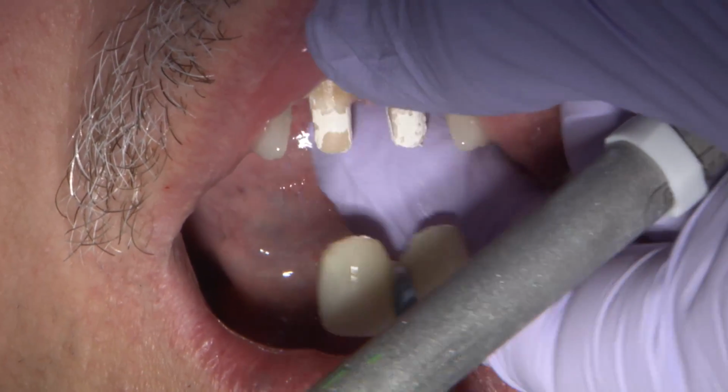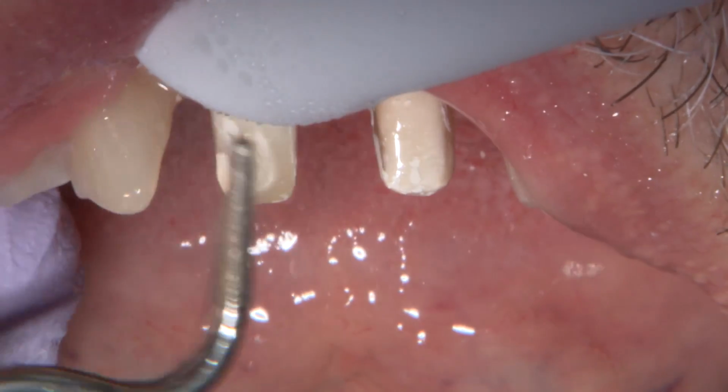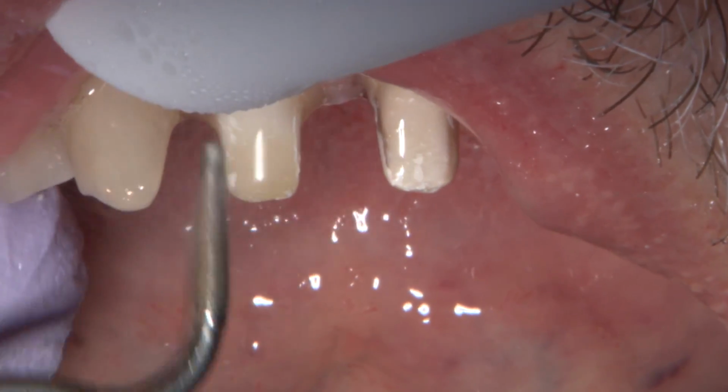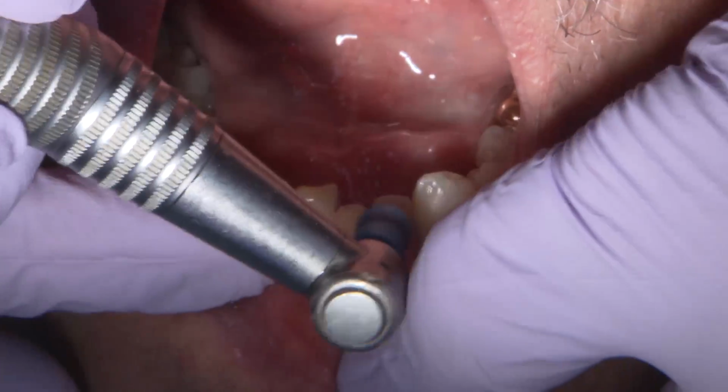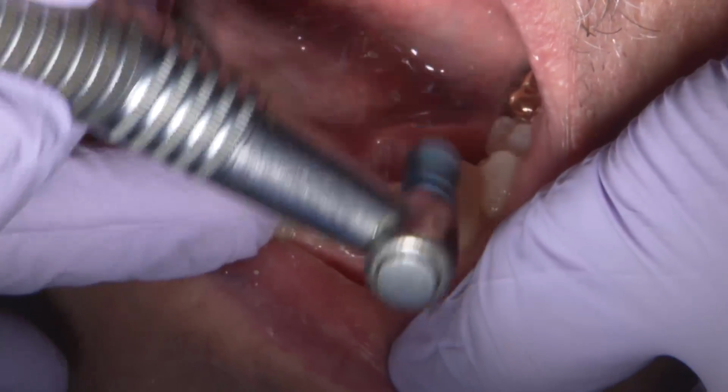Now, a few days later, for the delivery of our restorations, Will goes ahead and removes the provisionals, and we ensure the preparation surfaces are nice and clean, using both a Cavitron and Profi cup with pumice to ensure that all of the temporary cement and possible contaminants are removed.